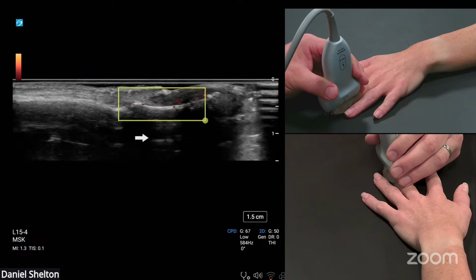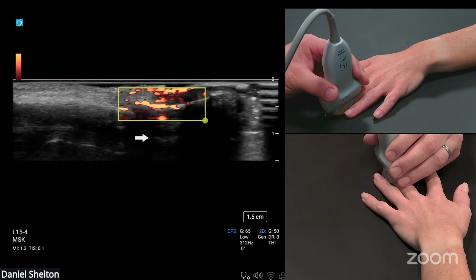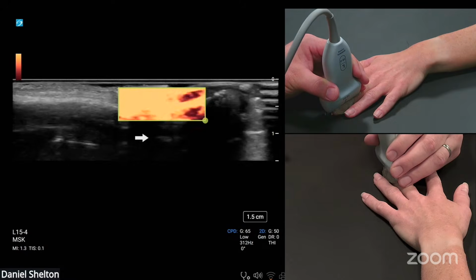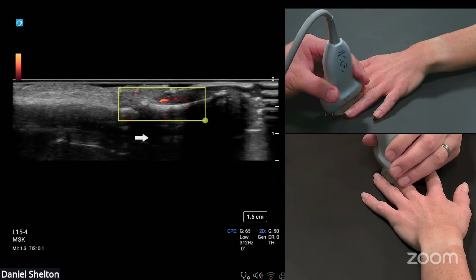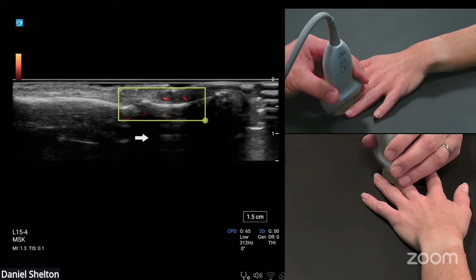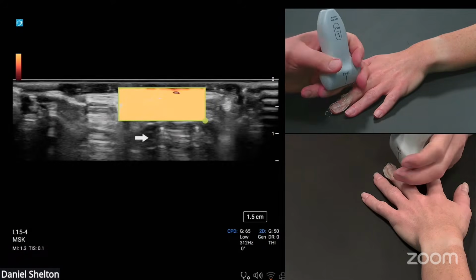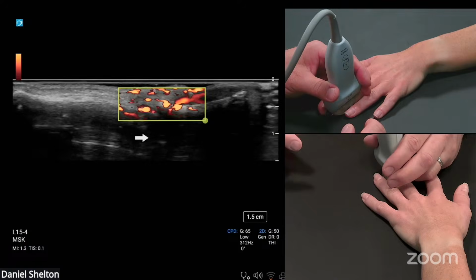And the difference between the colorized Doppler and power Doppler is that the directional or DCPD Doppler is basically using the computing power of the ultrasound machine to assign velocity and direction, and that takes a lot more computer processing. But if you switch over to power, it only uses the amplitudes of a signal. It is a bit more sensitive to motion artifact, but because it's not using the information necessary to assign velocity and direction, it does allow the ultrasound machine to process a bit more low flow areas, since we're just concerned with if there's blood flow there or not.